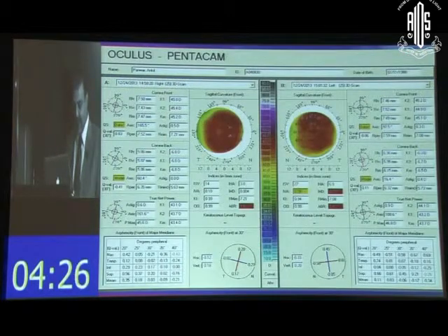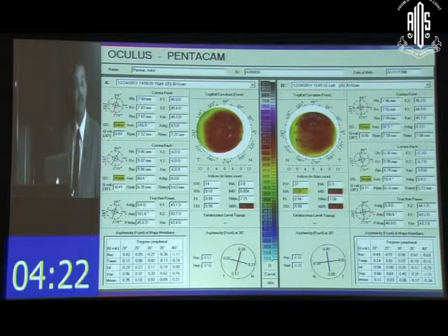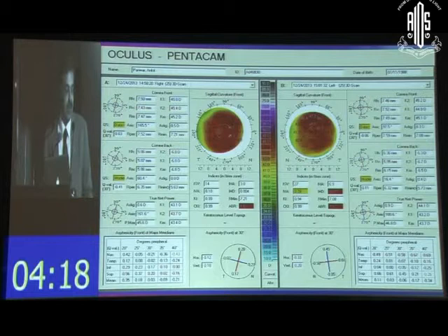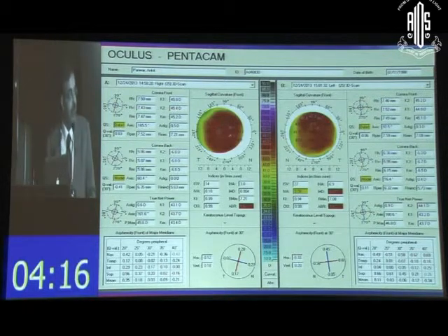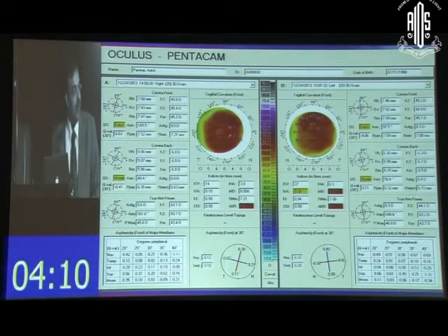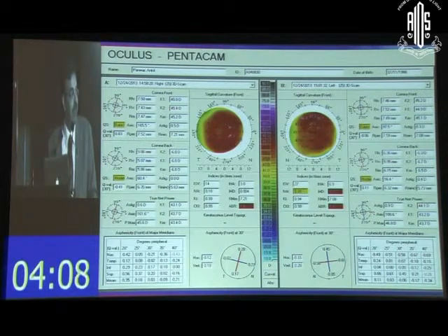The K values here are 45 on both sides, right? So exactly. Again, Dr. Ramamurthy, for K values, suppose you had to do 11 or 12 diopters maximum full ablation, right? And what would be your decision if you had a patient with K values of say 42? Would you change your? I don't want to leave the corneas less than 35 diopters flatter or beyond 50 diopters steeper. And exactly, thickness and K values alone do not.